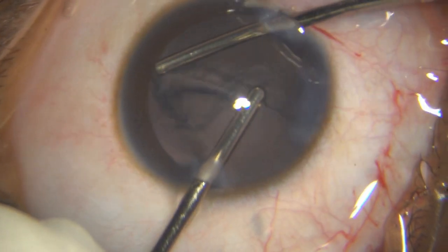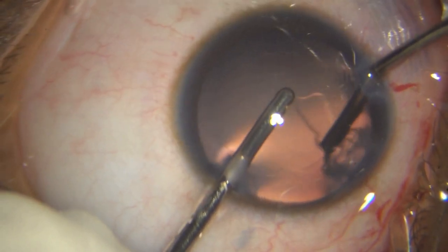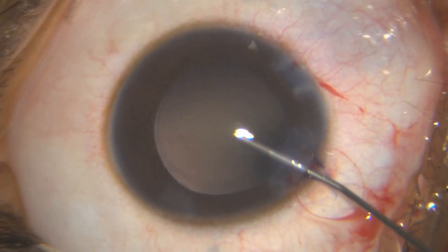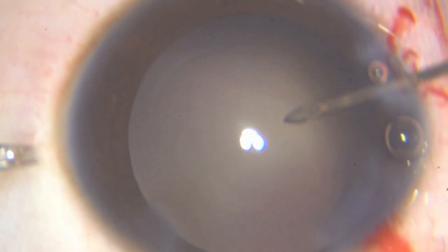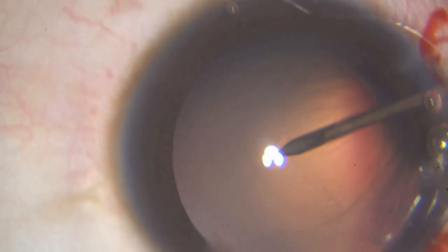I have removed all the cortex. I then put in my sodium hyaluronate once again, pressurize the chamber, and push back the posterior capsule. Going to a higher magnification, I am now going to puncture the posterior capsule with my 26-gauge needle and inject some ordinary 2% HPMC within the Berger space to separate the posterior capsule from the anterior hyaloid face.